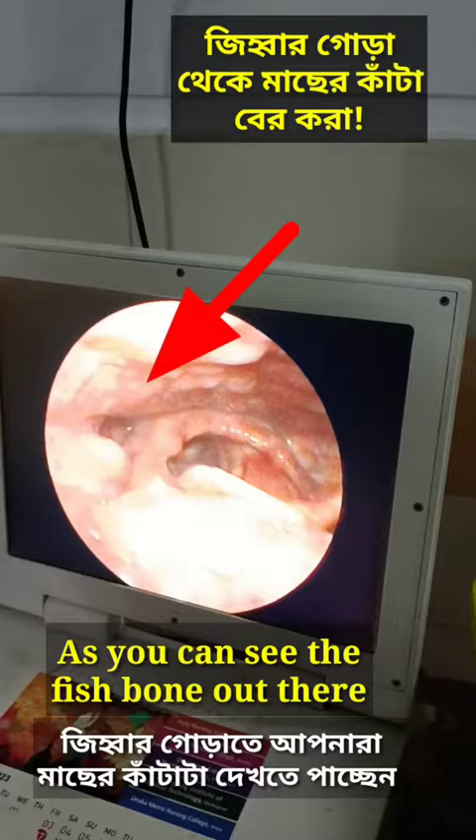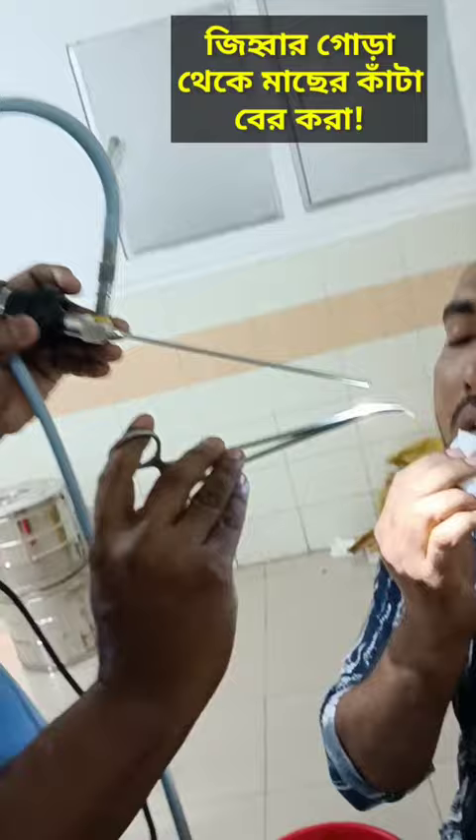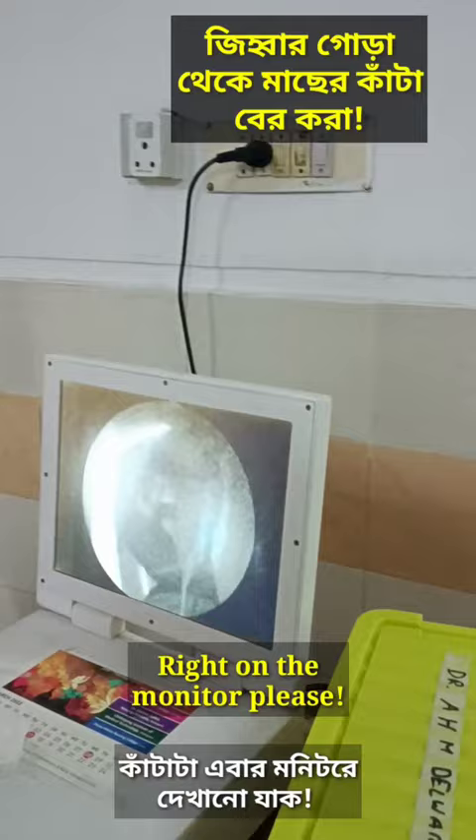As you can see, under video guidance, we will just find the image. As you can see, it came out so nicely. That's the fish bone that we have. That is the fish bone.